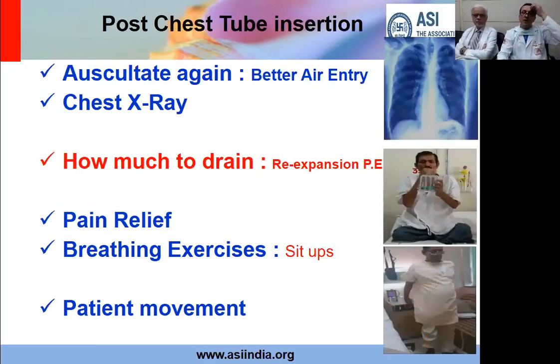Now, after you have inserted the chest tube and settled all the things, the first thing you should do is to auscultate the patient's chest. You have auscultated before insertion, you should auscultate immediately after insertion, and you would find that the air entry now definitely should be better because the air or fluid would have been drained. It's always important to do a chest x-ray as soon as the patient is stable, to document that, whatever reason I put it for, whether it was fluid or blood or air, it has now drained.